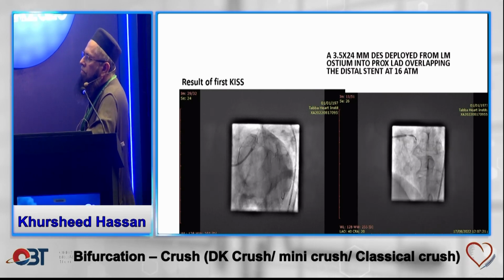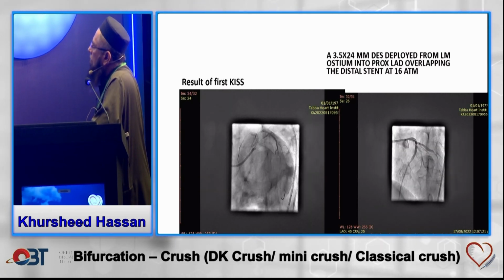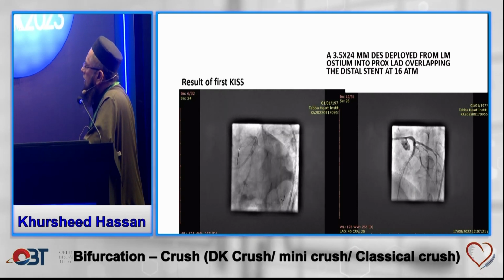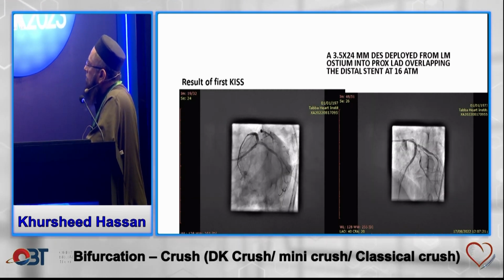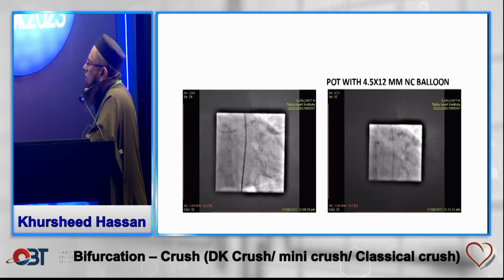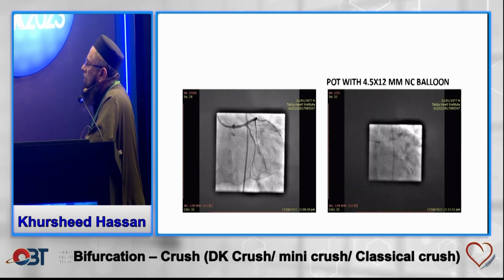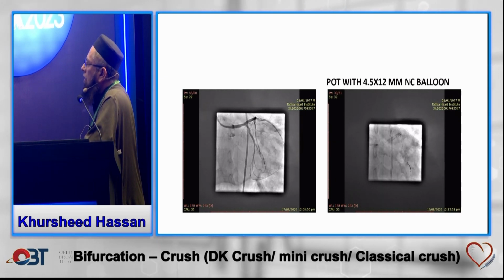So this is a 3.5 by 24 at 16 atmospheres, and the LAD stent is overlapped here. So this is the result after the stenting.